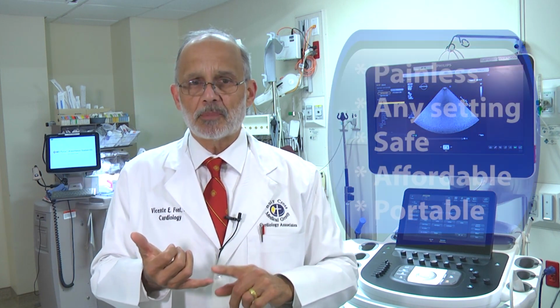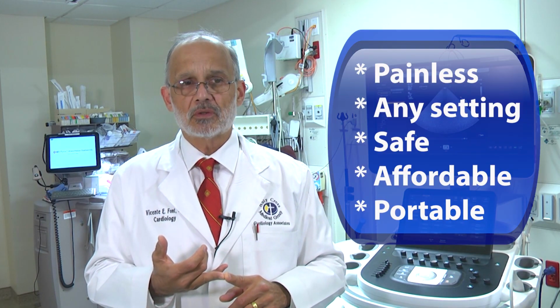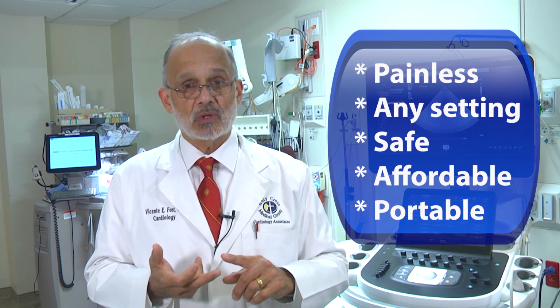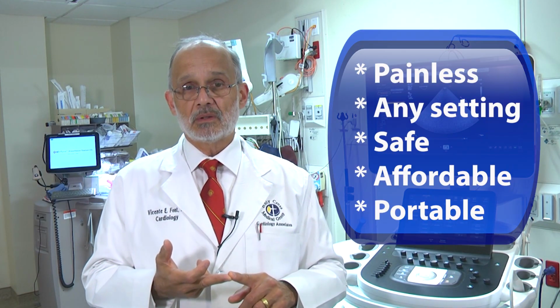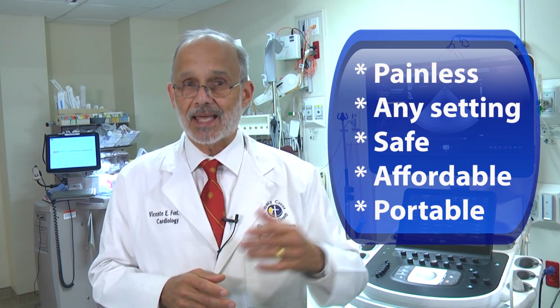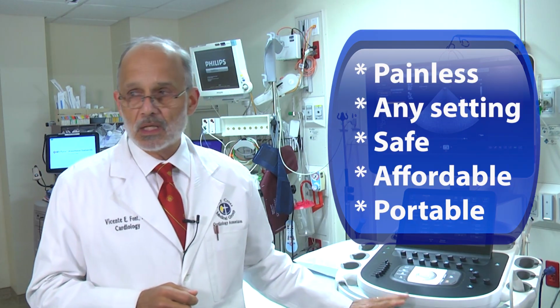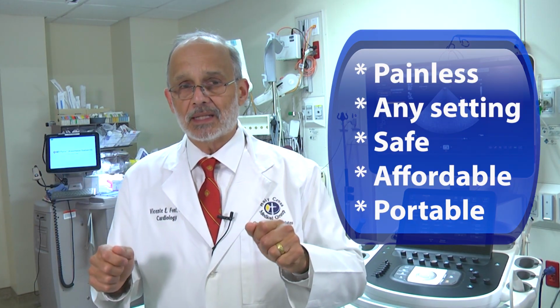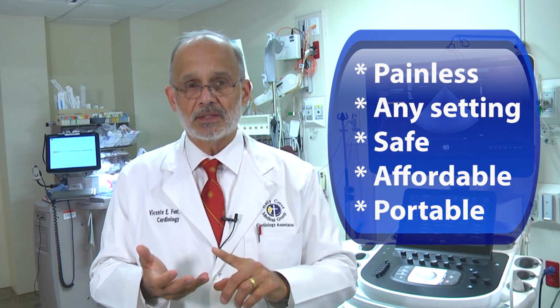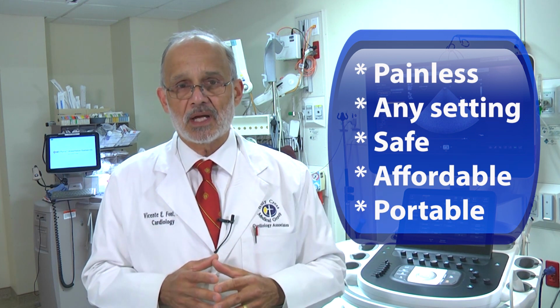There are numerous advantages of echocardiography that include, first of all, it's a very painless procedure. It can be employed in any setting without patient preparation, discomfort, or inconvenience. It is extremely safe, even in children or pregnant women, and does not have cumulative effects like radiation tests like CAT scans or MRIs. The equipment is very portable. You can see here, perhaps, it's a portable thing that can be moved to the patient's bedside, the intensive care unit. It can be taken to the operating room, where we do some other things there.